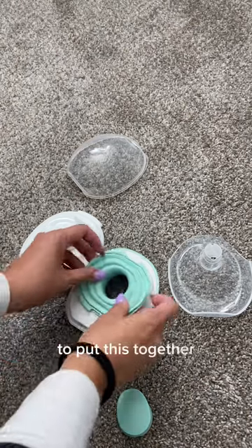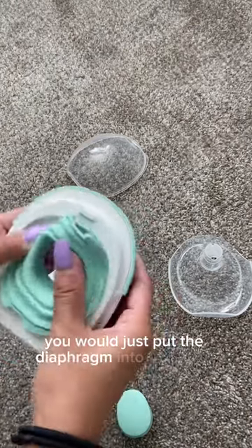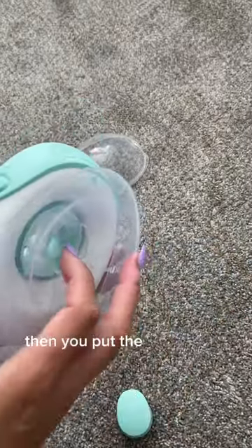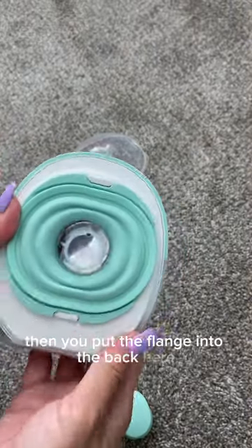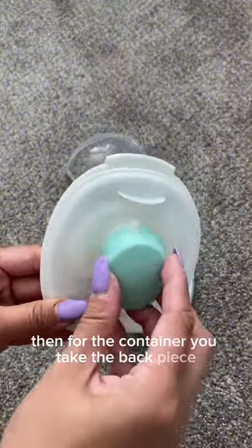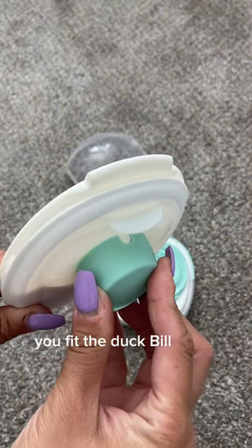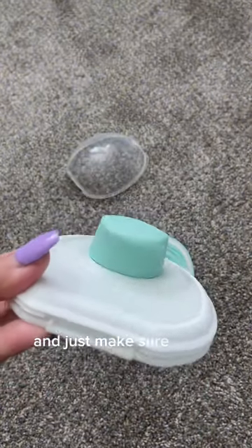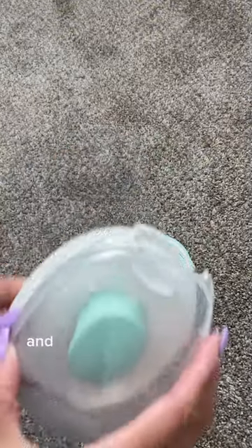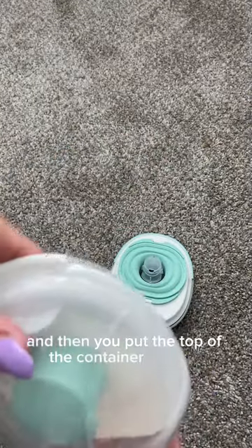To put this together, you would just put the diaphragm into the pump and line it up. Then you put the flange into the back. For the container, you take the back piece, fit the duckbill valve over top of it, and just make sure that it lines up properly. Then you put the top of the container on.